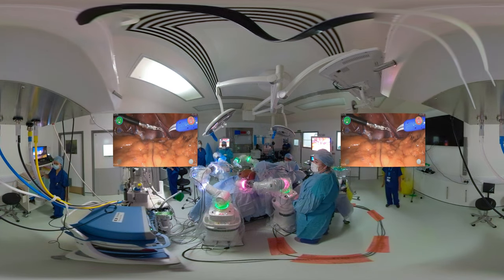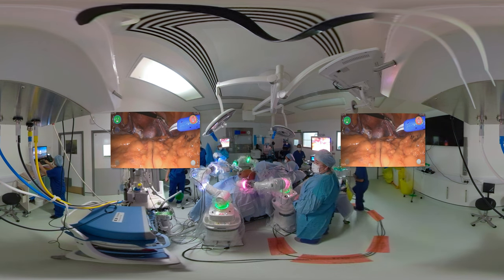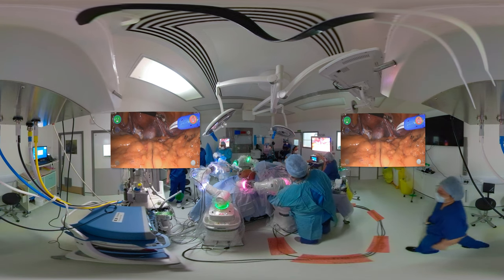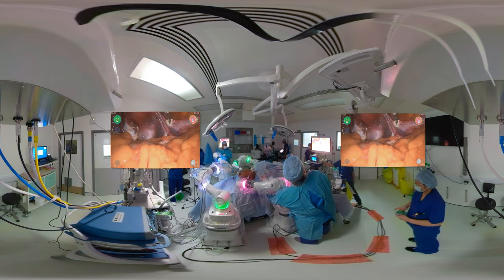I have done a similar step on the left hand side where I have introduced the bipolar grasper, port trained it, and this is the first surgical step which is the division of the round ligament. We are coagulating the round ligament on the patient's right hand side and then we're going to start cutting it with the monopolar scissors once it is coagulated.